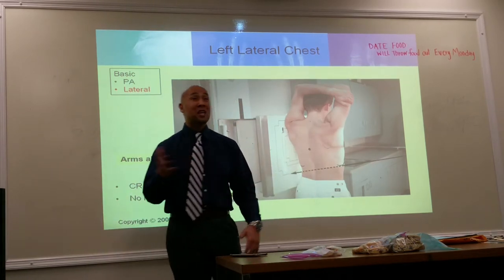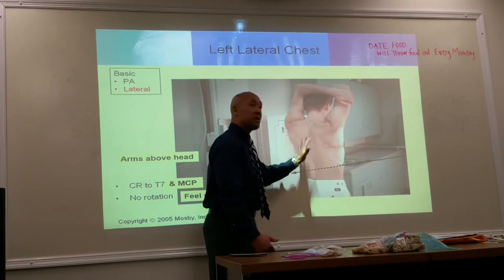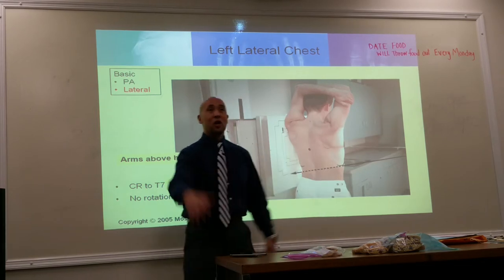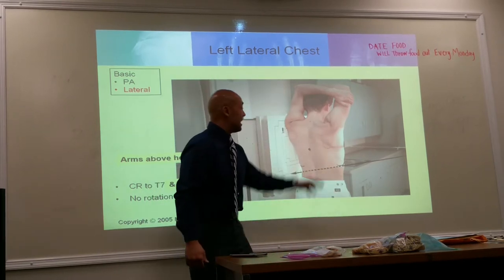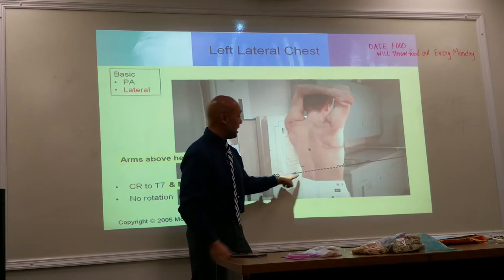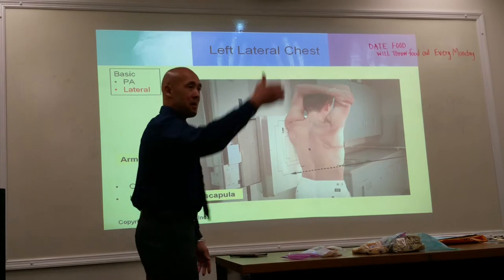Remember your divergent beam? This is what's going to happen. You have your two lungs. You have your left lung, which is up against the image receptor. No magnification. It's true to size, right? Now your right lung is going to be a little bit further from the image receptor. You're going to have magnification. Here's the other thing that's going to happen because of your divergent beam: it's going to throw that right lung down past your image receptor. So we're going to drop it about a half an inch to an inch to include the costophrenic angles of the right lung.